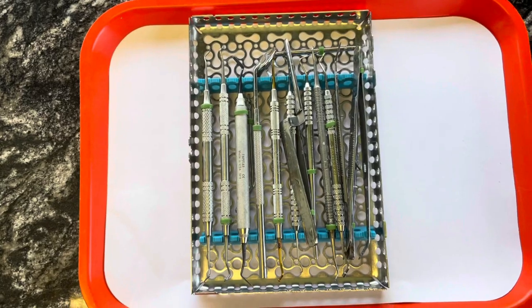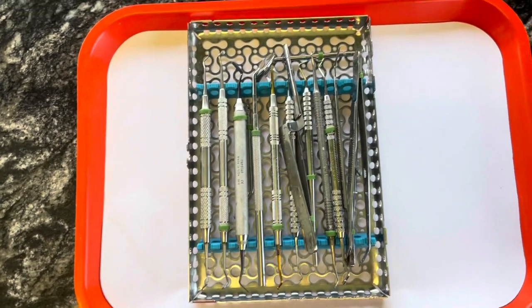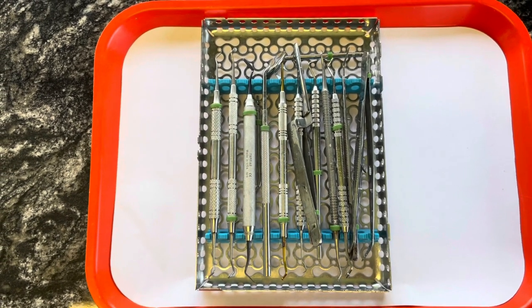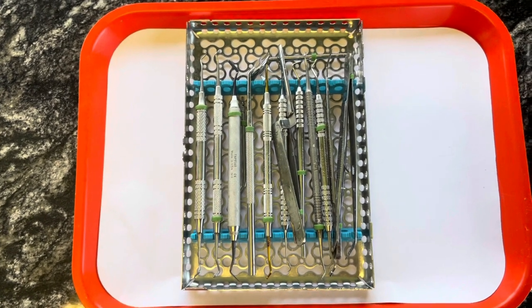I'm sure a lot of people do this, but if you don't know, now you know. So I'm going to take these instruments out of the cassette and lay them out, and then we will get into the names and what all of the instruments do.